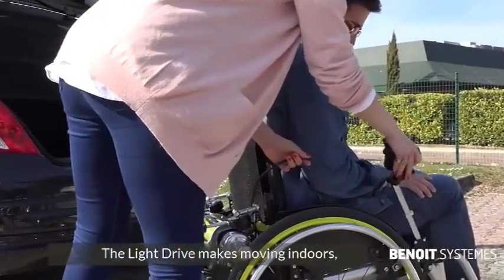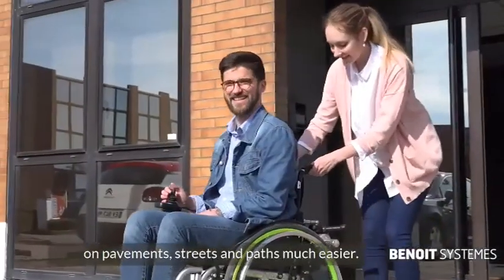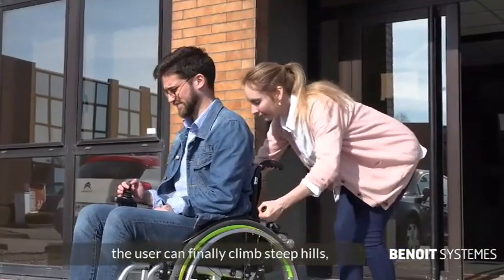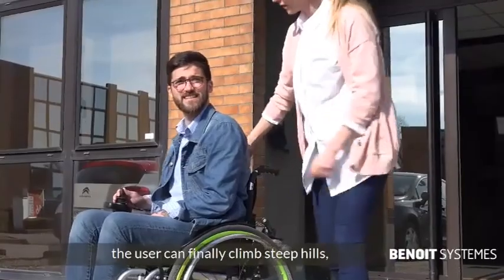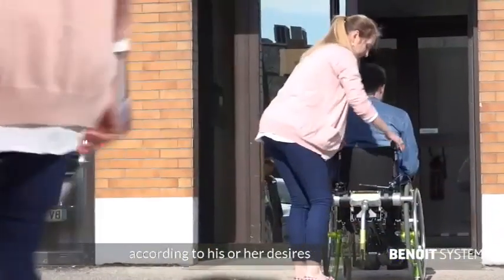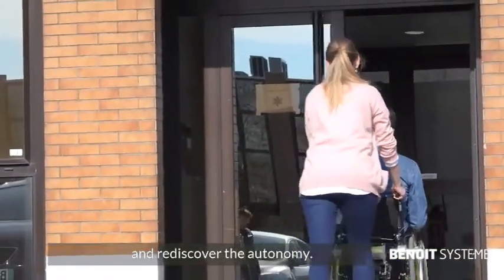The LightDrive makes moving indoors, on pavements, streets and paths much easier. Thanks to the LightDrive, the user can finally climb steep hills, run on grass or gravel, and move effortlessly according to his or her desires and rediscover their autonomy.